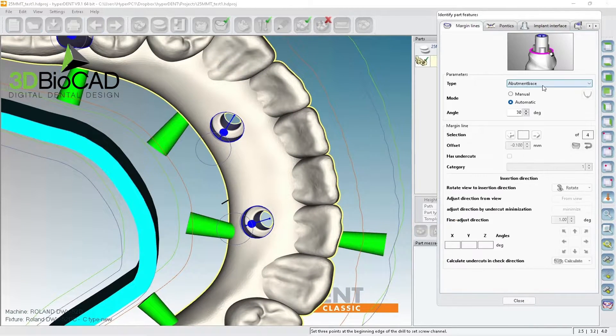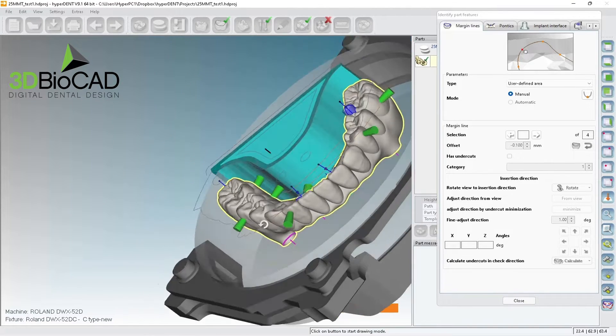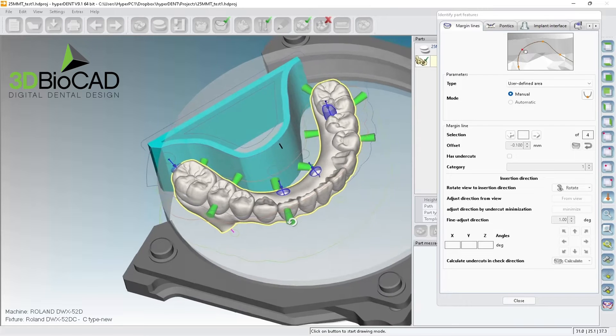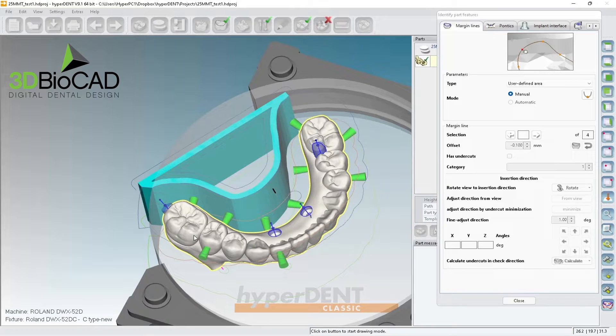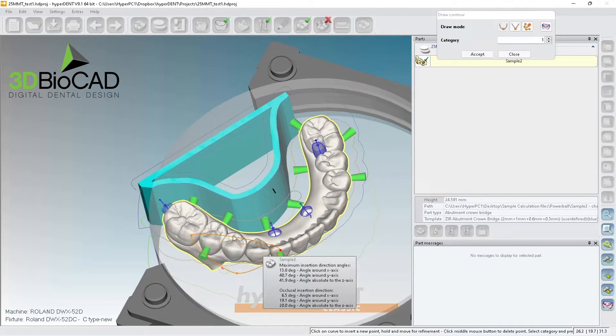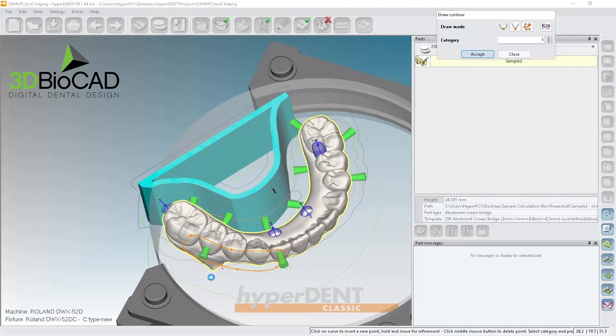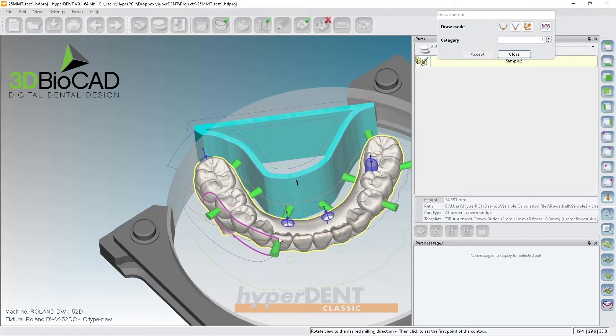Now we have to do the user-defined. This works for DCI users — sometimes with the DCI, if you want to utilize the disk changer, I'm not able to have the open space area, so I have to do user-defined. I'll click here and draw it like this — I'd probably put just one here because even with this angle I can still see the gums.